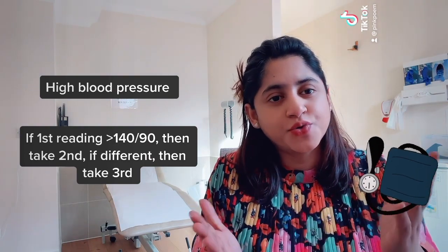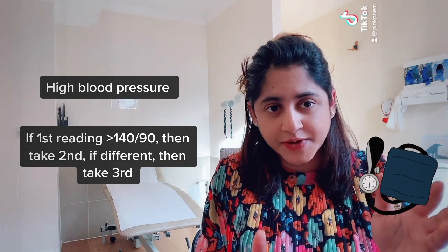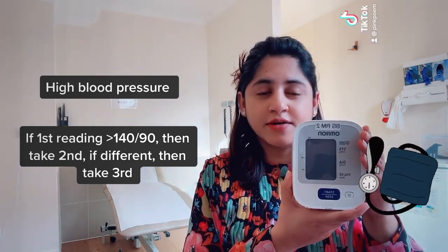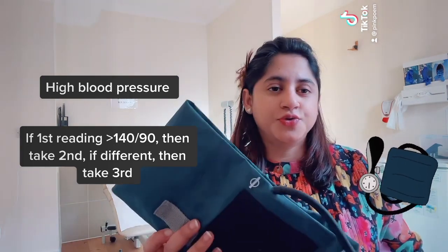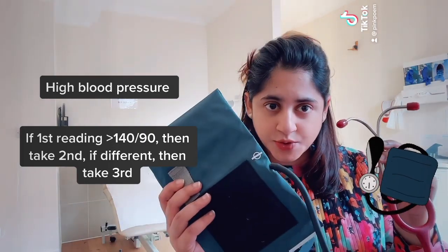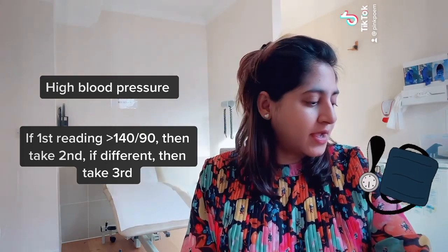Now, there are two ways to monitor blood pressure in general. One of them is by using the electronic machine. Another one is to take the reading manually using a stethoscope and this cuff.